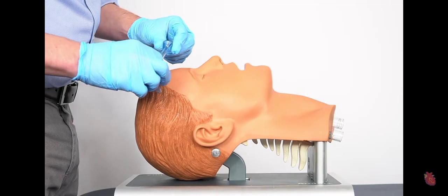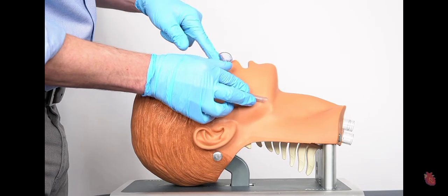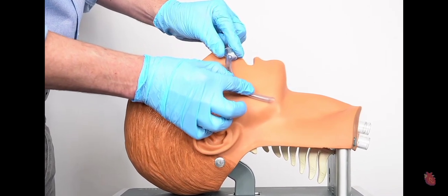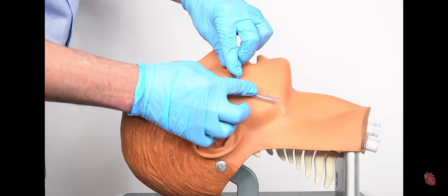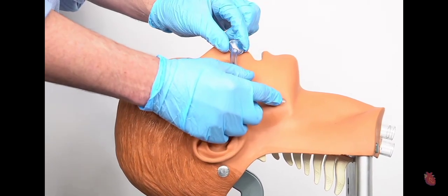Once the nasopharyngeal airway is in position, it's going to sit roughly like this, with the flange at the nostril, the first part of the tube going along the floor of the nasal cavity, and then gently curving around so the tip is sitting in the back of the oropharynx.